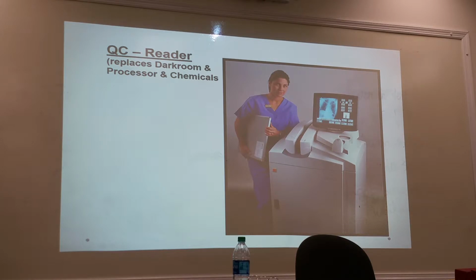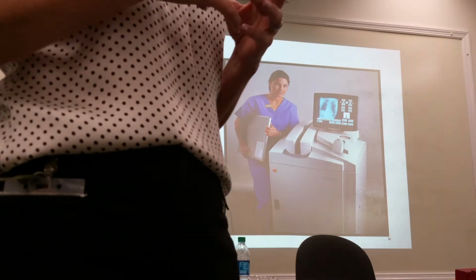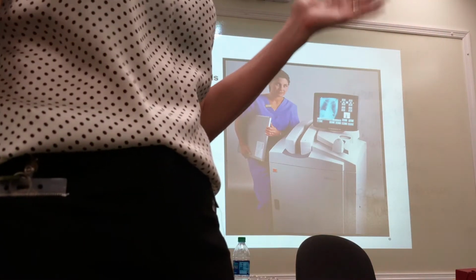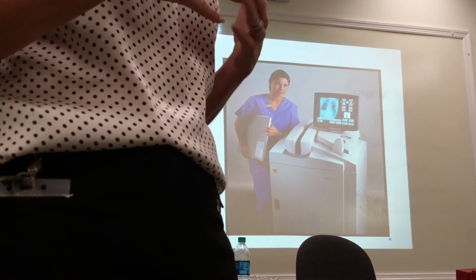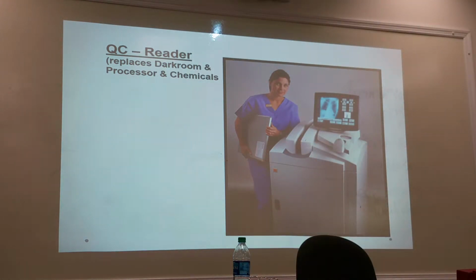So Anaheim Regional and Anaheim Global, maybe in Whittier, still have full CR, and they're working towards transitioning to DR. I think I told you this before, that if a hospital wants to get reimbursed by federal funding like Medicare or Medicaid, then they're having to go to DR. So now hospitals are being forced to do that. Mammography legally cannot be taken unless it's digital.